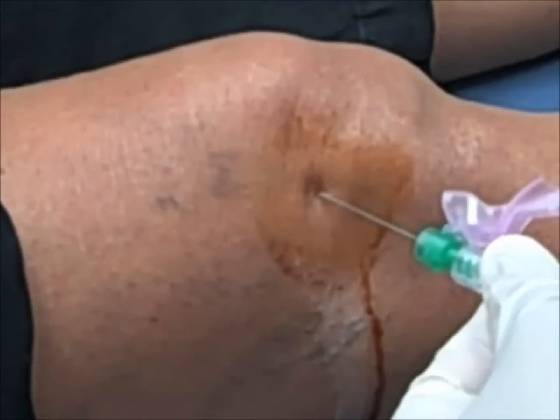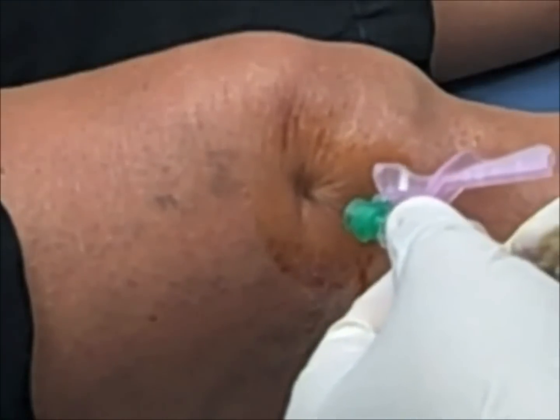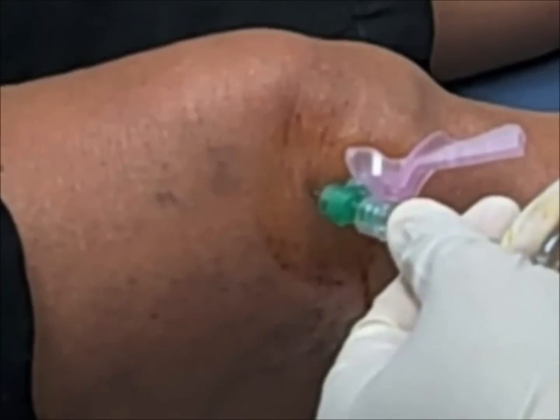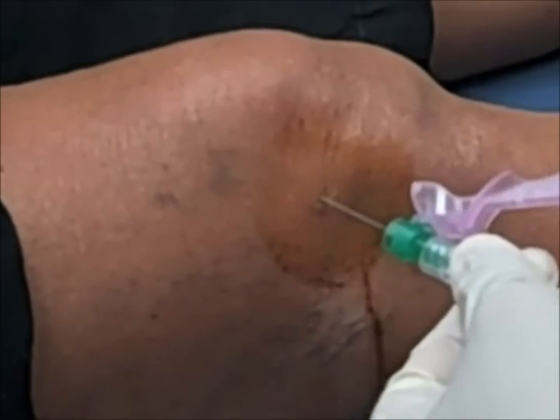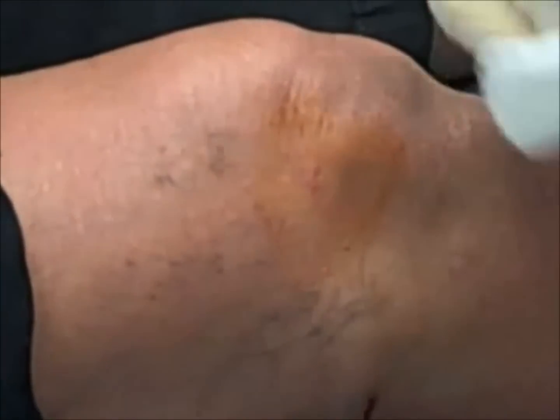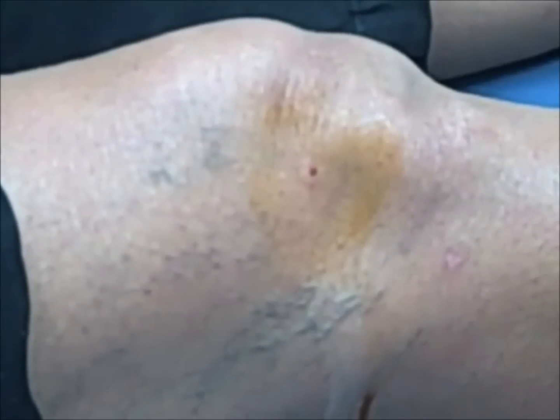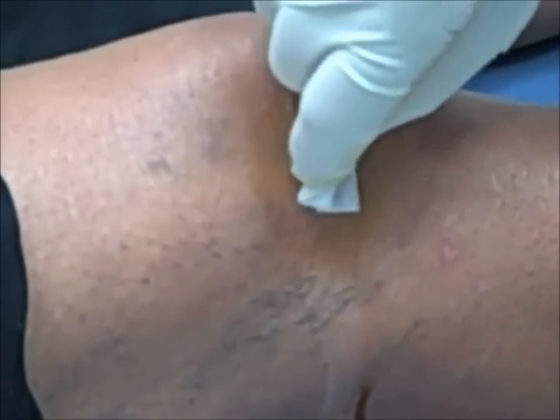Keeping the needle perpendicular, we'll advance it slowly and inject the medication. Again, if you encounter resistance while advancing the needle or injecting medication, reposition slightly until it flows smoothly. Again, clean off the skin from excess betadine and apply a Band-Aid.